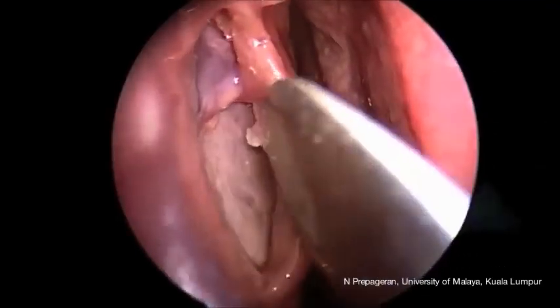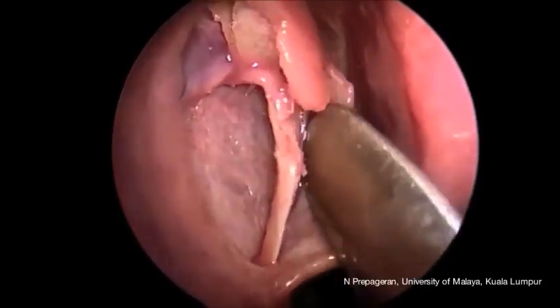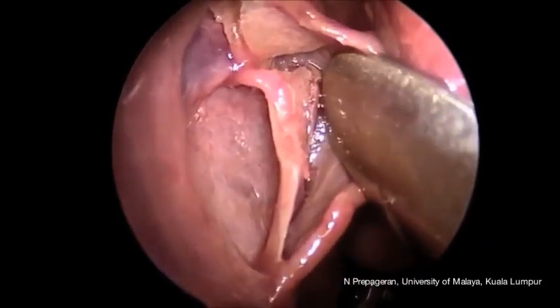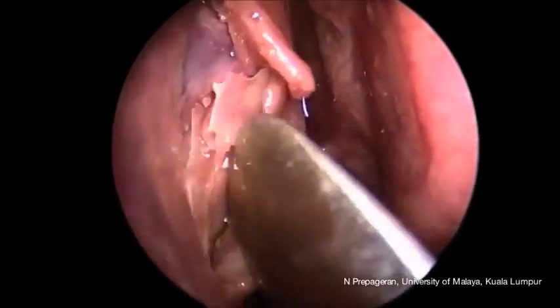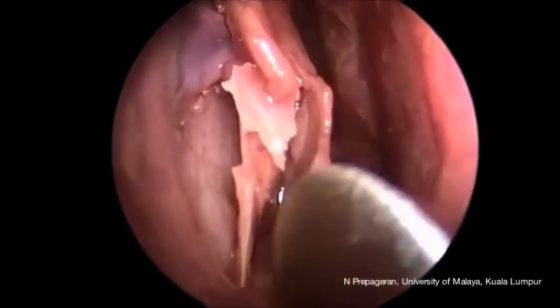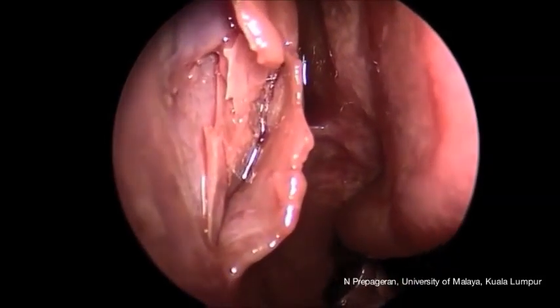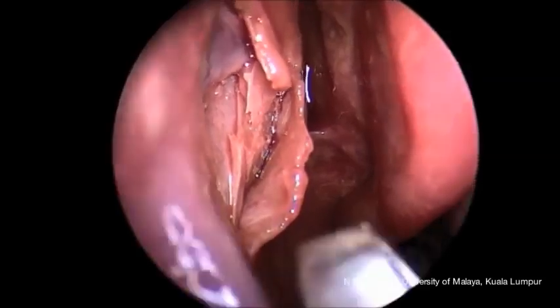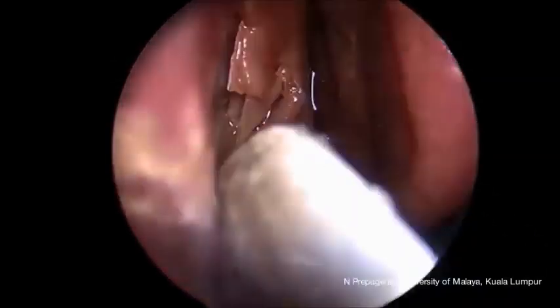What I've done now is to elevate the uncinate process and to show you the blind sac of the uncinate process itself. It's like a sandwich with a mucosa medial and lateral to it, and the bone right in the center in the form of a boomerang. So this is how an uncinate process folds over the osteomeatal complex and the OMC recess as well.